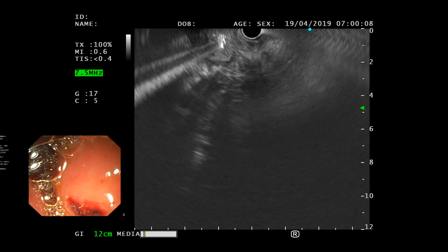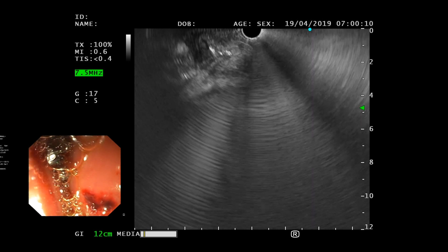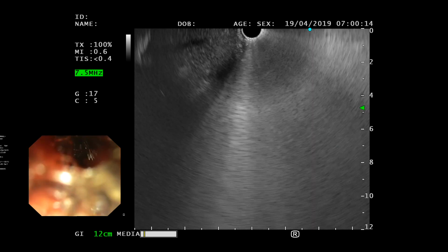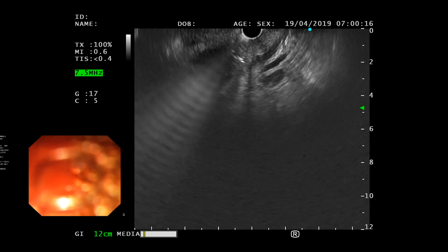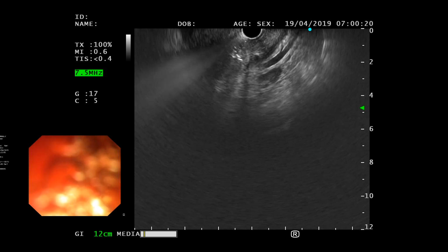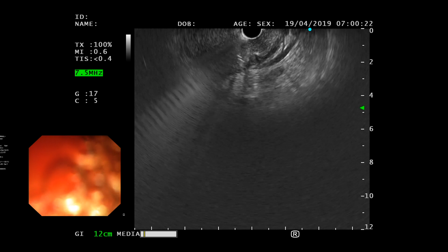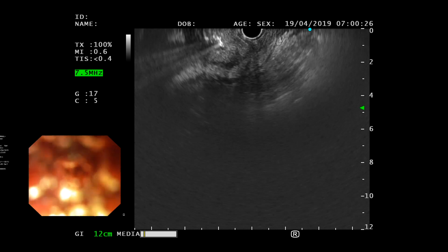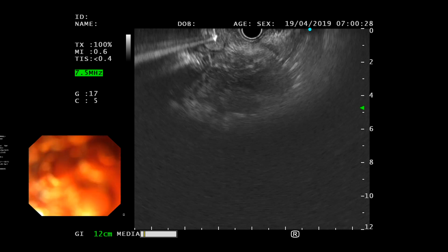नहीं, लेकिन आप हाइलम वाली साइड पे नहीं गए अभी तक, तो हाइलम वाली साइड पे जाओ ना. सबसे पहले CBD को आइडेंटिफाई करो in its entire length and then turn to the left and go towards the hilum. Is there a PT stone as well? No. Can you show us the PT? Okay.